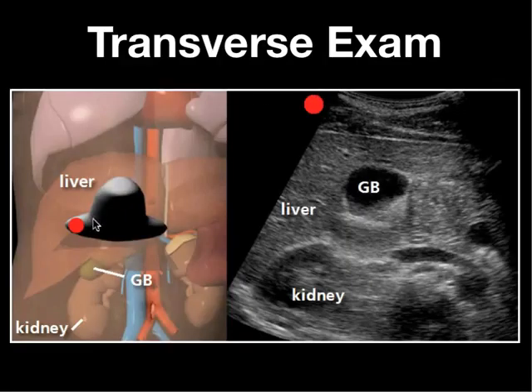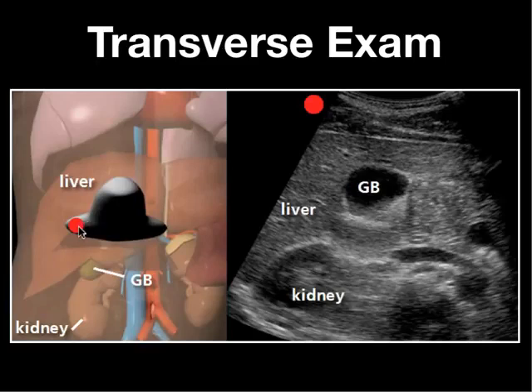What about the transverse exam? Whether you start in the sagittal or transverse plane is personal preference. If you start in the transverse plane, you're going to be in the subcostal region at about the midclavicular line, with the indicator towards the patient's right — anterior, posterior, patient's right, patient's left. Here you've got the liver and the right kidney. The gallbladder is going to be anterior and medial to the superior pole of the right kidney.